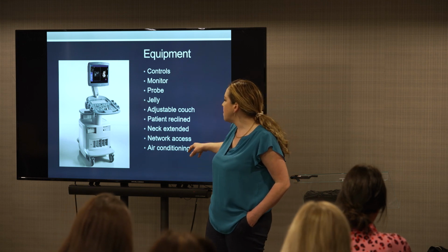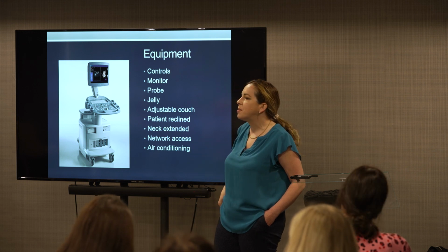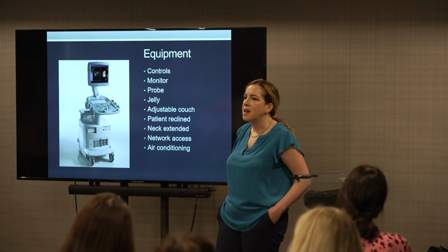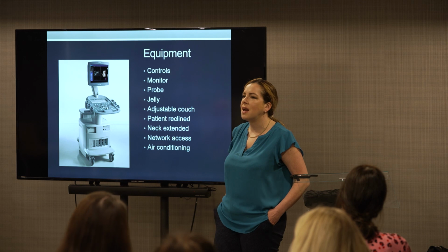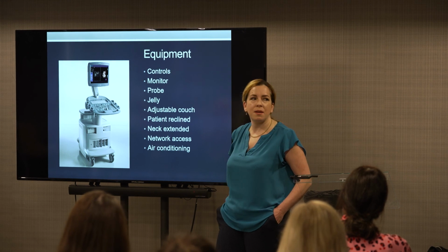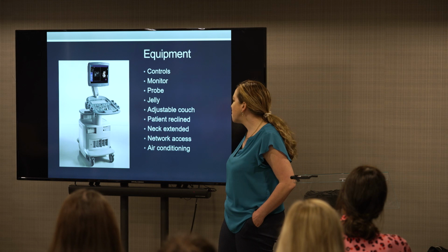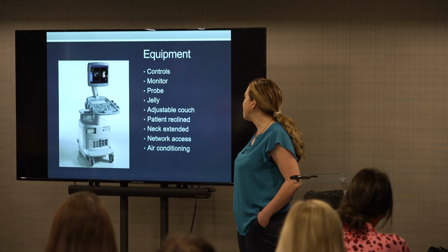And I just added this on for this talk, but air conditioning is really important. So in our breast unit, we've just added a third ultrasound machine. It's all ready to go, but no one wants to work in there because there's no air conditioning in there yet. So ultrasound machines are basically like a big radiator. So you will really struggle, even in winter with windows open, you can really struggle to work. So it's just a thought if you're setting up a big, decent, powerful ultrasound machine.